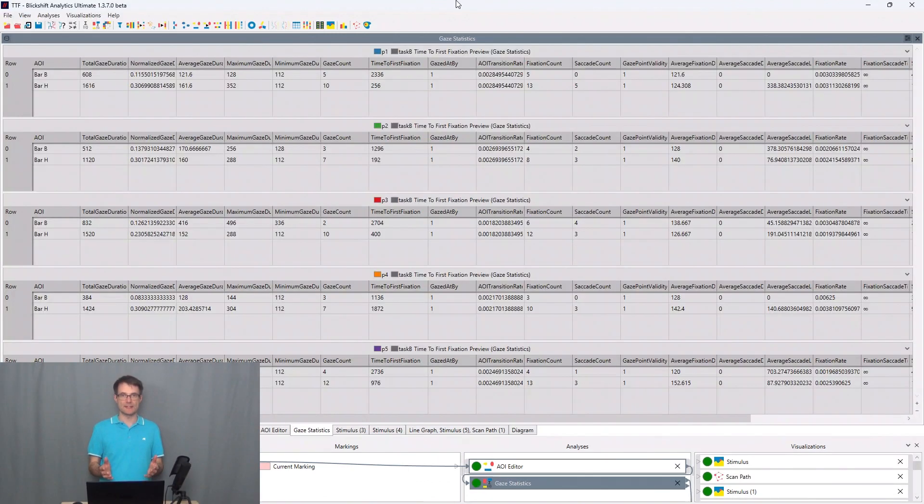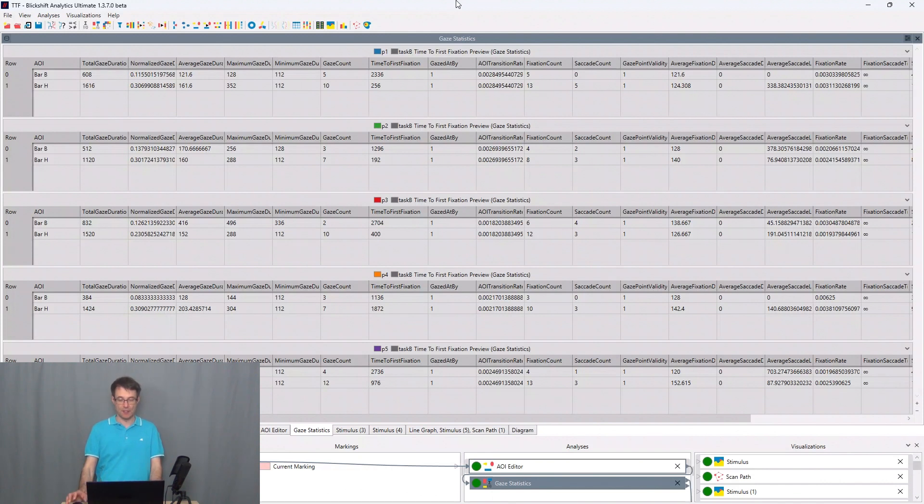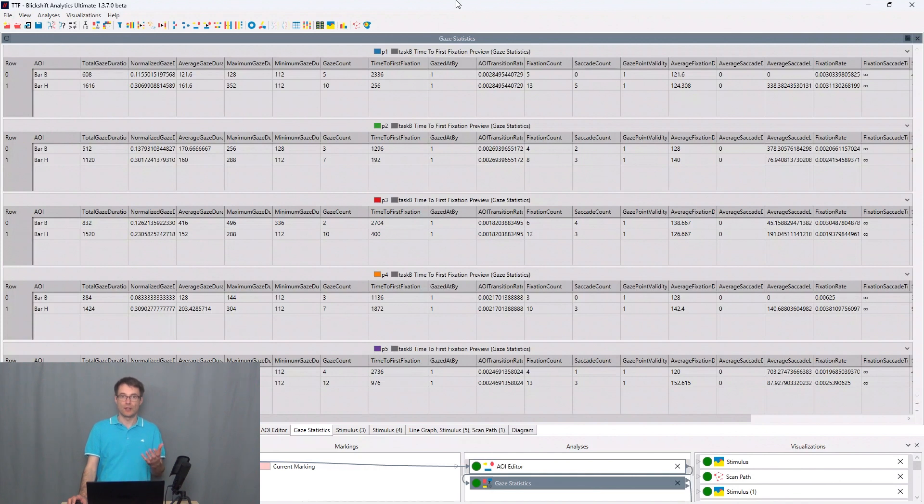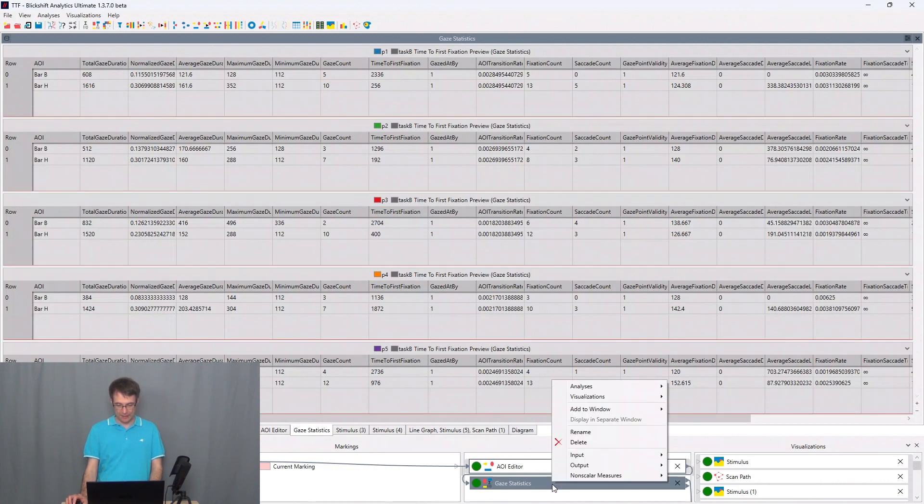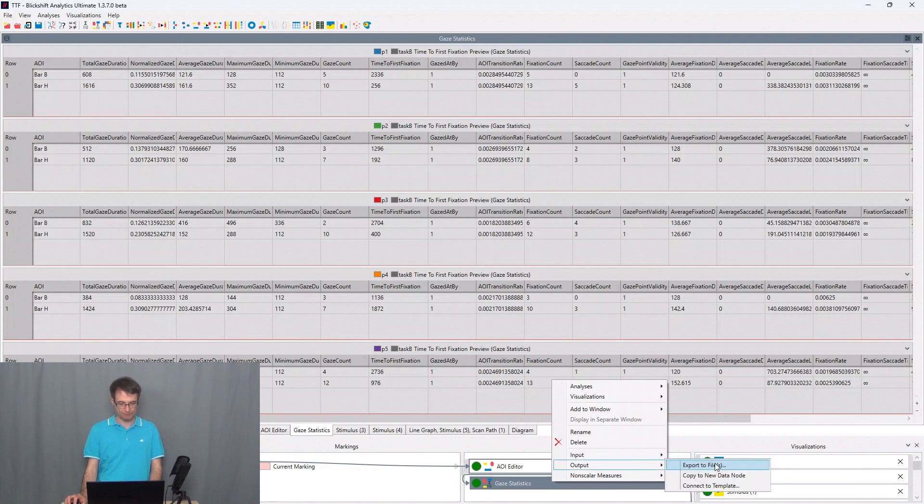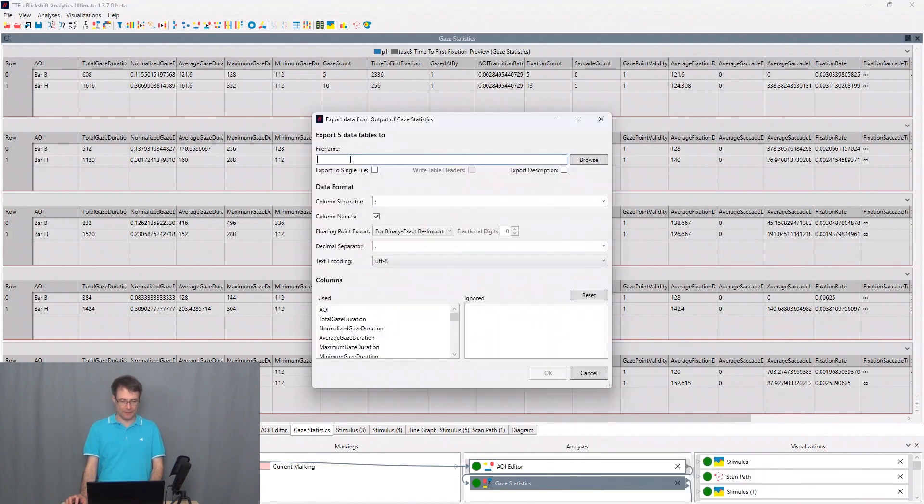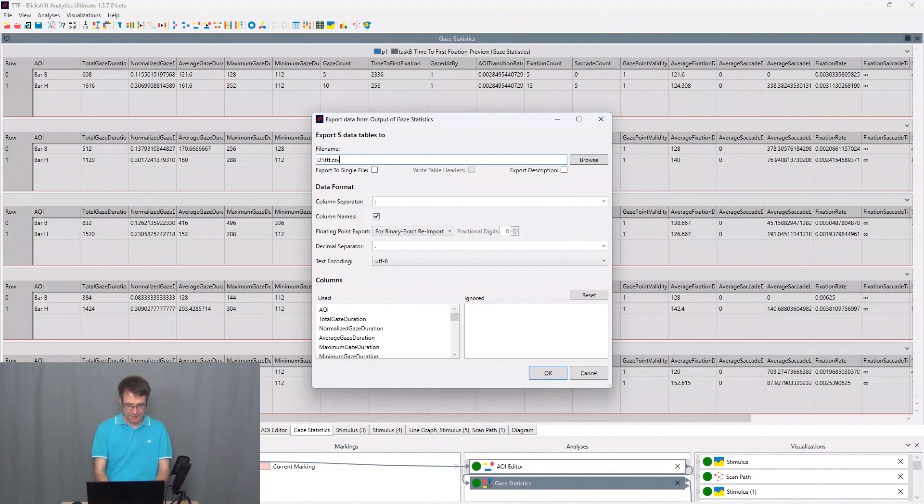Besides visualizing the time to first fixation values in BeGaze analytics, you can also export this data for a later statistical analysis. So I go to gaze statistics here in the workflow to the node. And I make a right click, say output export to files.